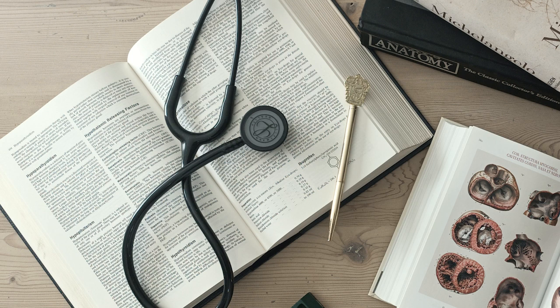And just to hammer it home again: ectopic, extrasystolic, premature. All mean the same thing. An early extra beat. Yes, keep that straight. This systematic approach is invaluable for medical students, especially when facing a complex ECG.